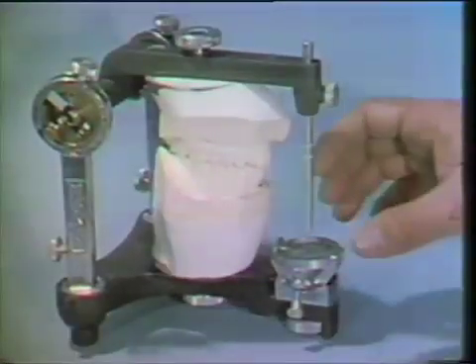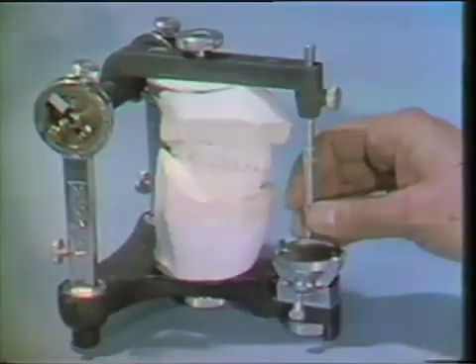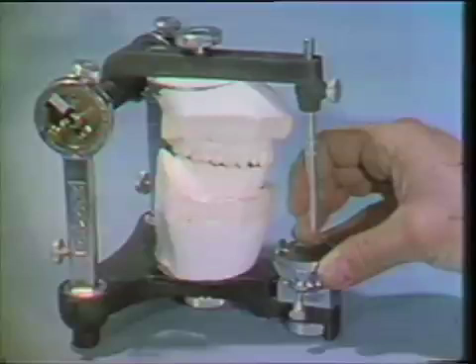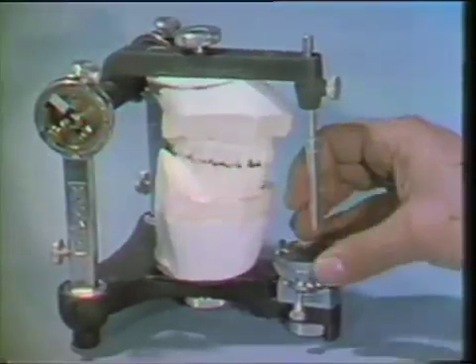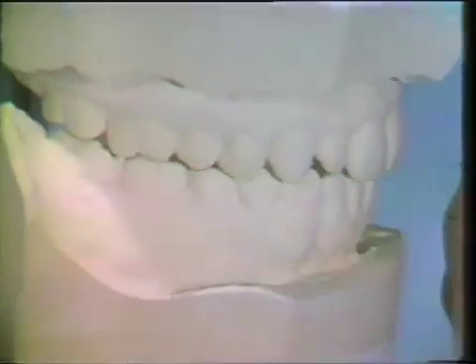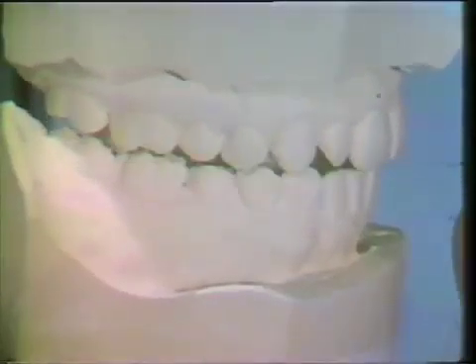This film will illustrate the fabrication of a bite plane on articulated casts. The technique for mounting casts in a semi-adjustable articulator has been described in a previous film. The mounted casts of the patient to be demonstrated display a slide from centric relation to centric occlusion.